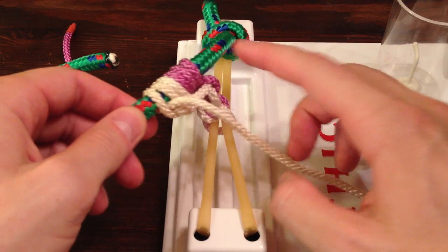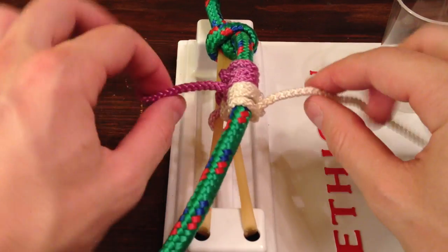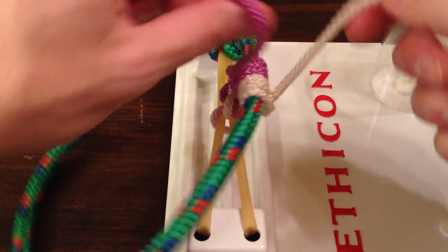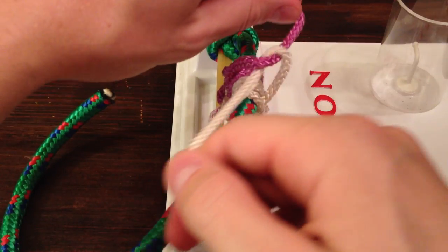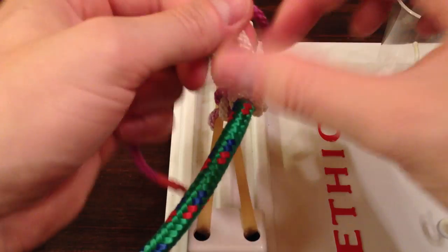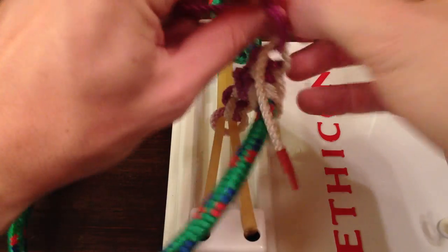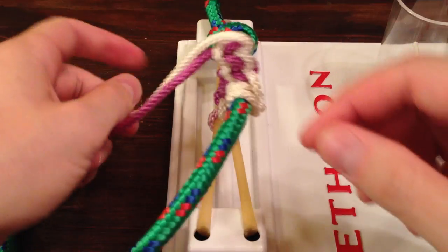Alright, so now we've tied our drain to our knots. The last part, we just want to secure our free ends — we're going to tie these together on top. You can do this one-handed, two-handed; it doesn't matter, whatever you're more comfortable with. Just like before, you don't want these to be really tight because you don't want to occlude your drain. Three or four knots in this case should do, just enough to keep it from unwinding.